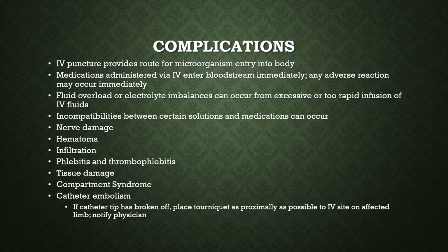So infiltrations can be serious, and when we have an infiltration of our IV, when we notice it, we remove that IV immediately. That's always the first step. Remove the IV immediately. Now, how do we know if an IV is infiltrated?